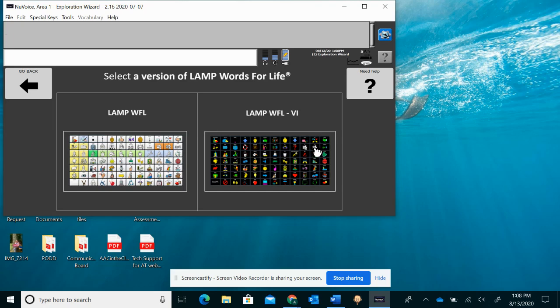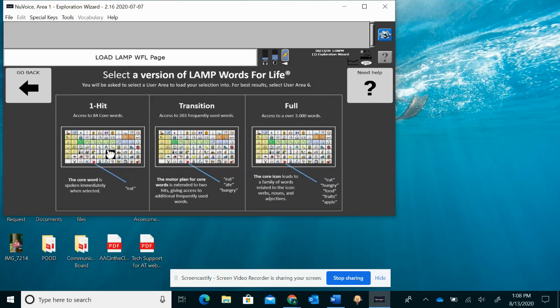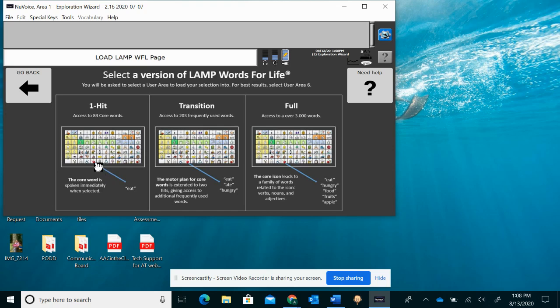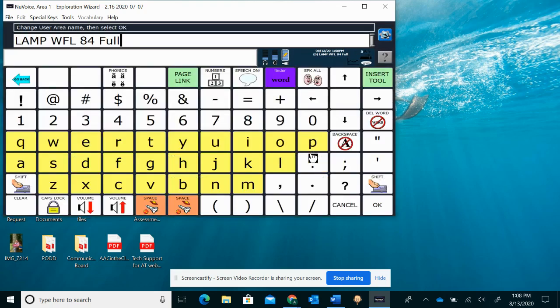I'm going to choose Lamp Words for Life. This is Lamp Words for Life for visual impairment. We have one hit, transition, and full. I'm going to choose full. Difference meaning one hit. They press an icon one time and it says the word. Transition gets them started on full. Most of your students are going to be on full.